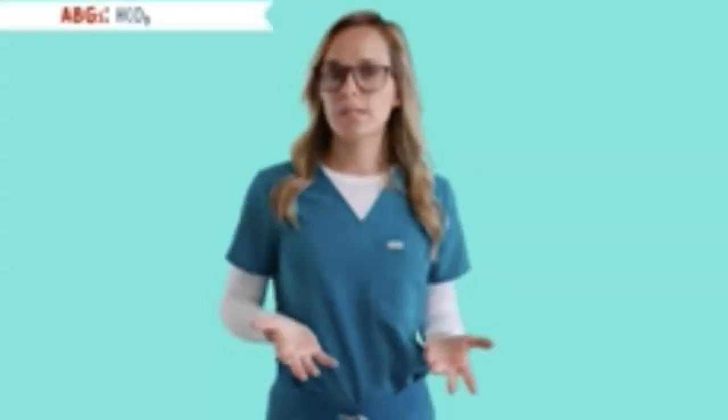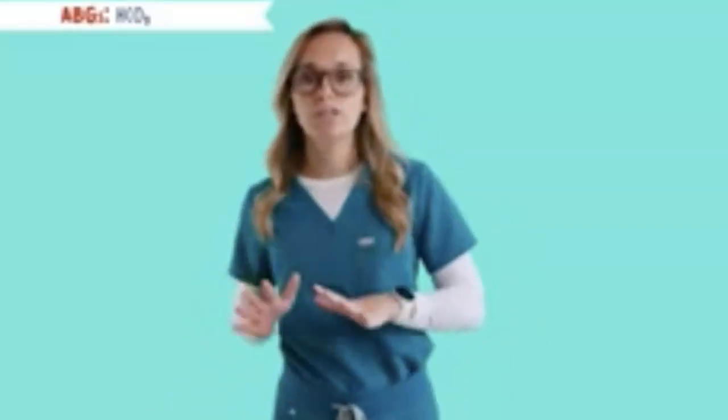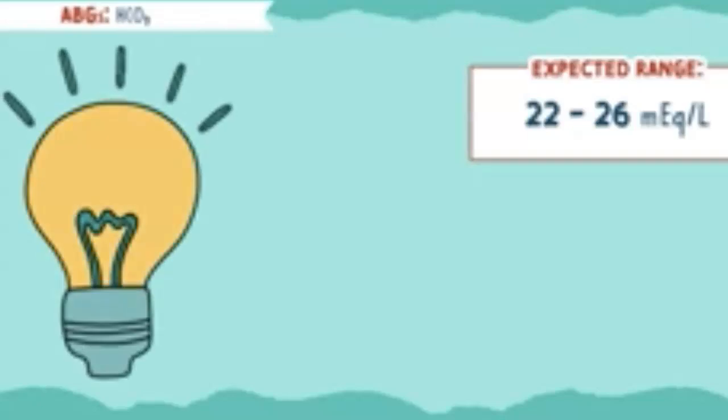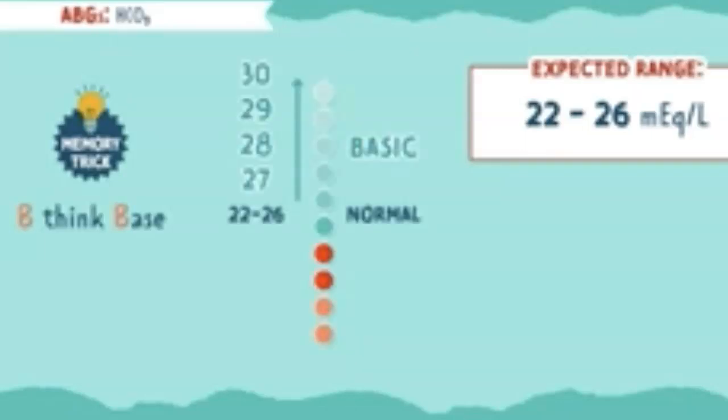Next on the list is bicarbonate, written as HCO3. HCO3 is a measurement of bicarbonate in the blood. It maintains the blood at a normal pH. It does this by acting as a buffer. A normal HCO3 is, do you remember? 22 to 26. HCO3 is different than CO2 because HCO3 is alkalotic, also known as basic. You can remember this by the memory trick, bicarbonate, think base. So the more HCO3 you have, the more basic your blood is. And the less HCO3 you have, the less basic your blood's going to be, meaning it's more acidic.